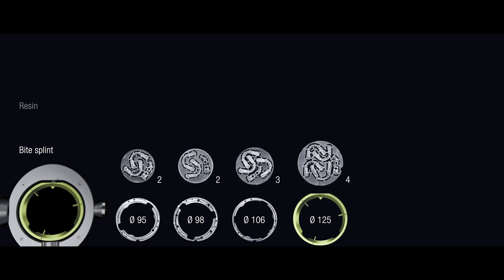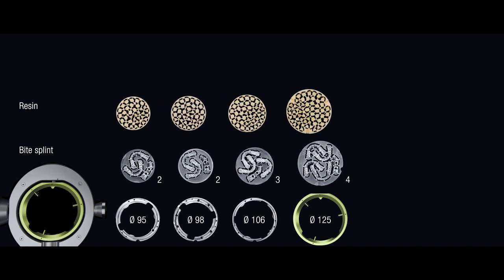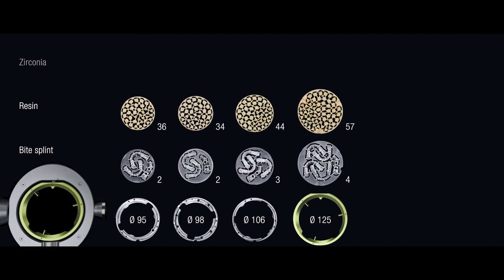Less vibration means that your milling results are much more exact. As you can see in this short presentation, in combination with special holders, material blanks with a diameter of 95, 98, 106, or even 125 mm can be elaborated for the first time. This means an oversized bridge that would not fit in normal blanks can be positioned and milled without any problems. Also, bite-splint production doubles, and in one single milling process a much larger number of crowns can be manufactured than before.